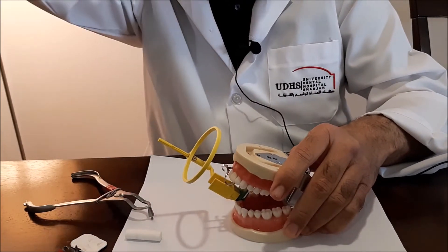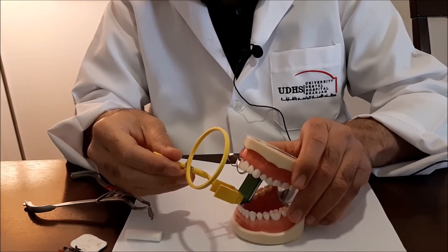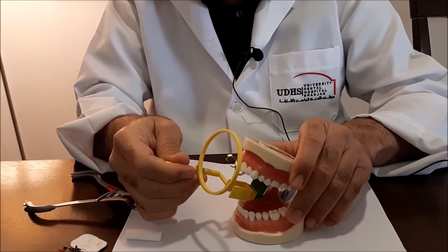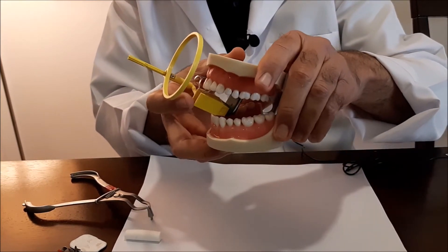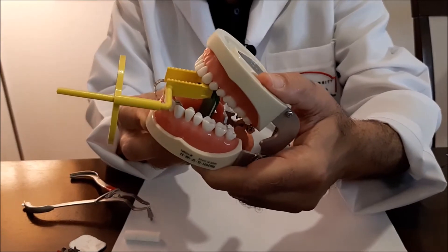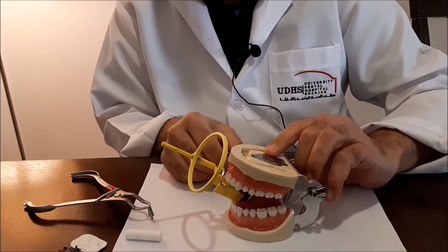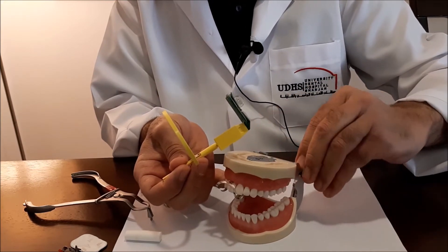The correct technique is to ask your patient to open, tilt and incline the sensor holder, and push it as far back as you can go inside the oral cavity, leaving the minimal amount of bite block extending outward. Notice how far the film goes inside toward the palate — this will definitely allow the sensor to capture the whole image. I will show you the difference between the two approaches from above.